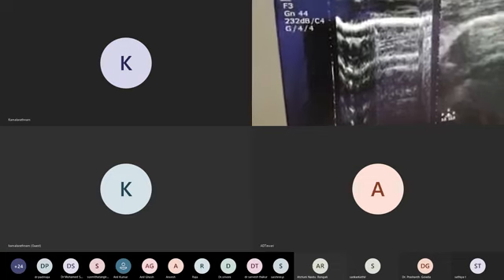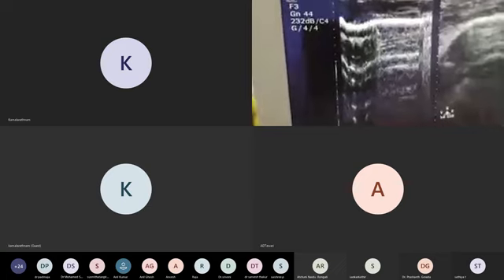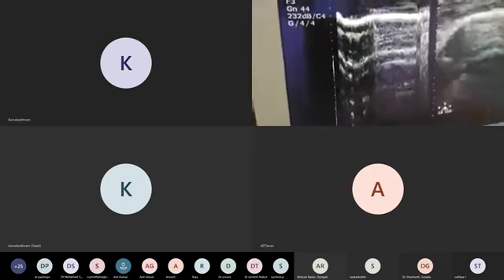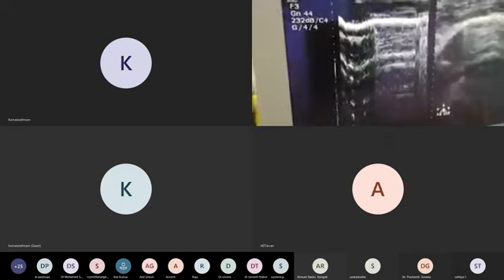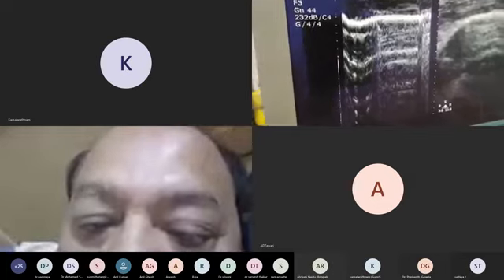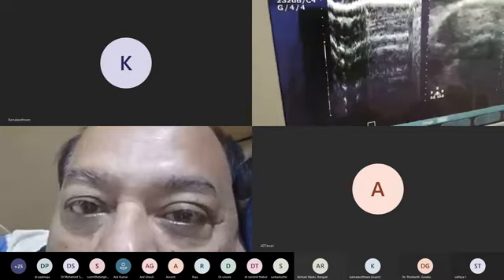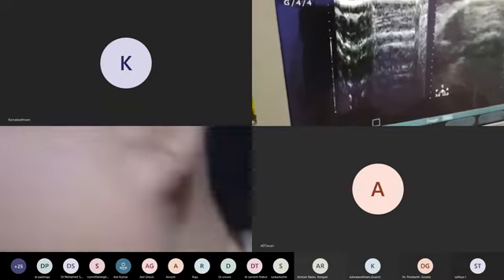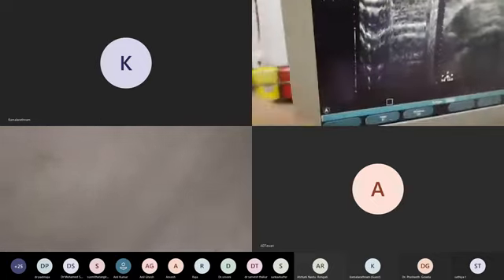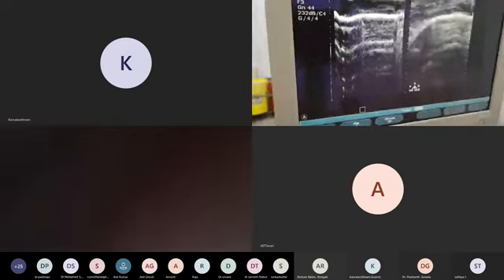Okay, and suppose in an adult only, because we are now in the neonatal, I don't want to talk towards the adult side. Okay, so it is simplified in 20 minutes, this much. If you want lung ultrasound, there are cases, each and everything. One day on the critical adult side, I have seen a pleural nodule. Then I told him, please send him for the CT scan. He might be having secondaries.